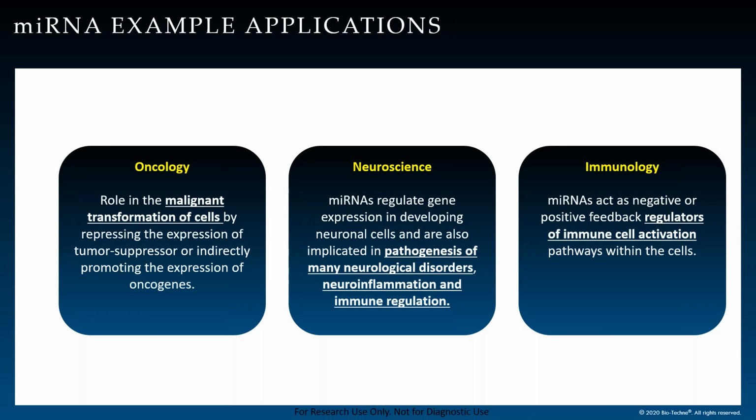There are a few key research applications where miRNAscope could play a significant role in detecting microRNAs. The first is oncology, and in oncology, microRNAs in the past have been shown to alter the transcriptional landscape within single cells. And in this way, they may induce malignant transformation of those cells.